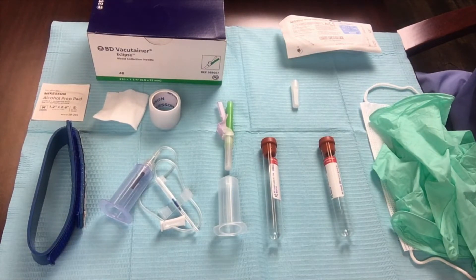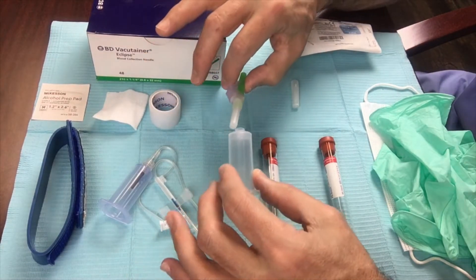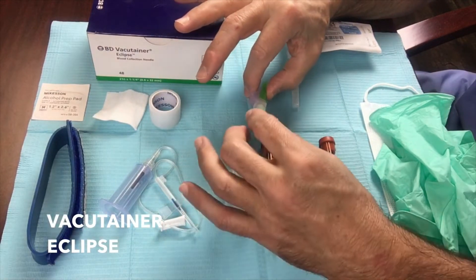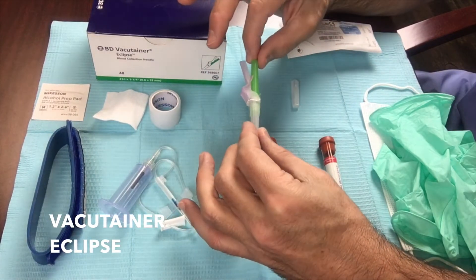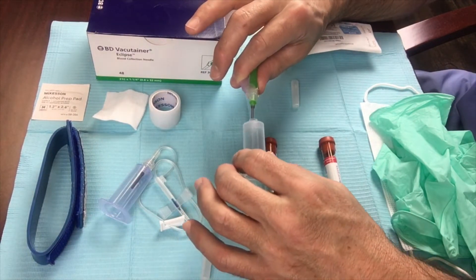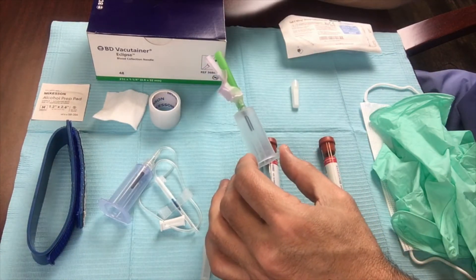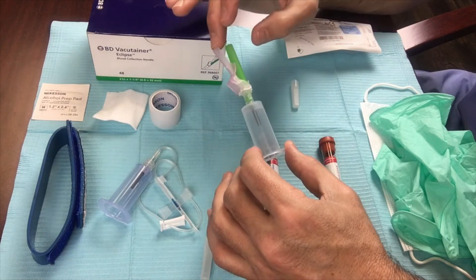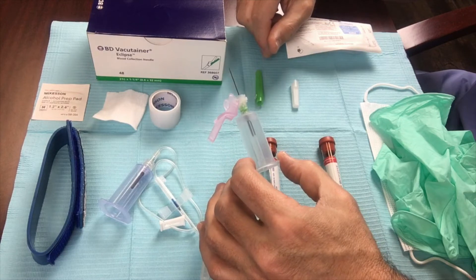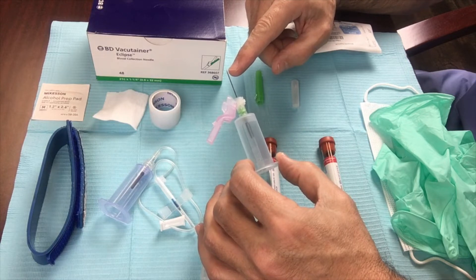You have a couple of options. Basic option number one that I use more often than not is this system: a holder — the plastic piece — and what we call a vacutainer eclipse needle. We remove the clear end off of the vacutainer eclipse needle and secure it into the holder. It screws right in. Once in place, you remove the green cover which exposes the phlebotomy needle. The needle is beveled, and we'll go over the detail of how to do this in an actual patient in a later video.